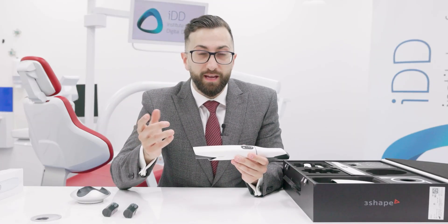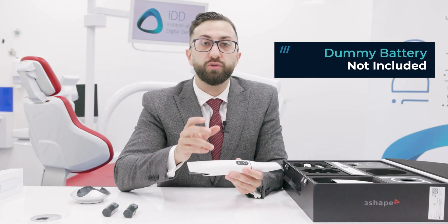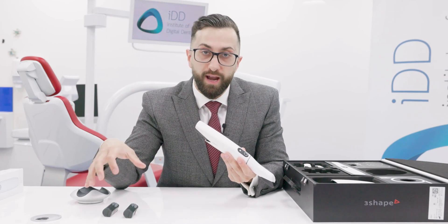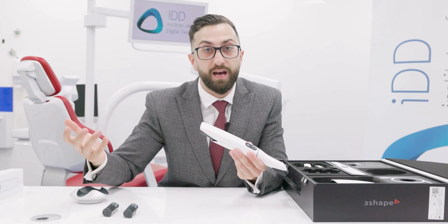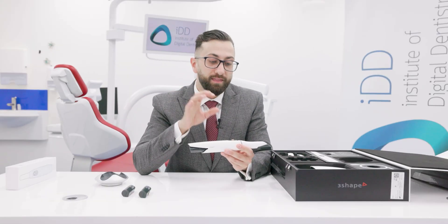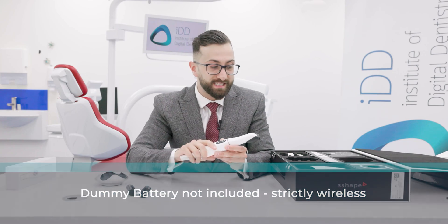Interestingly, the company is so confident in these batteries — and they give you three — that there's no longer a dummy battery included with the Trios 5. With the Trios 4, if the batteries ran out, you could plug in a dummy battery directly into the cart or laptop to use it as a wired scanner. With the Trios 5, there's no dummy battery, so you need to ensure that you always have at least one battery charged, otherwise you can't use the scanner.